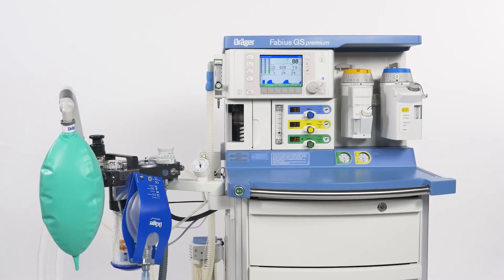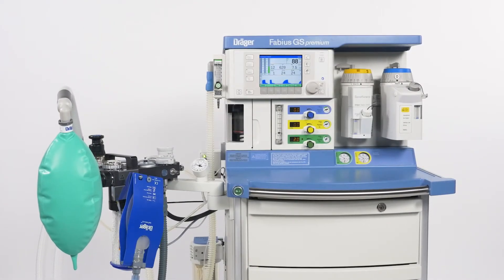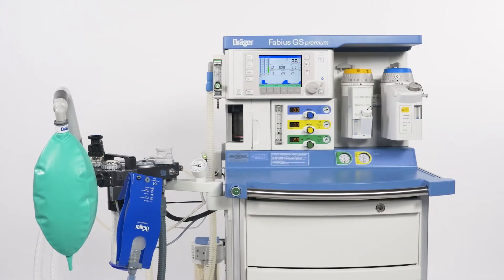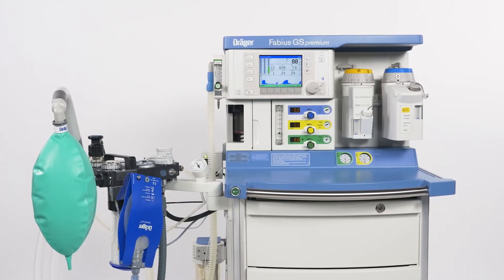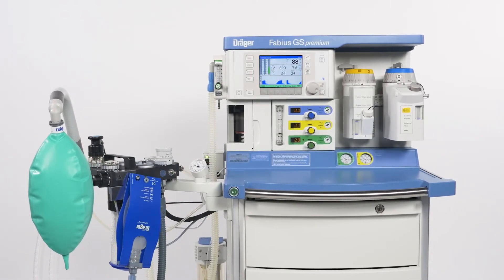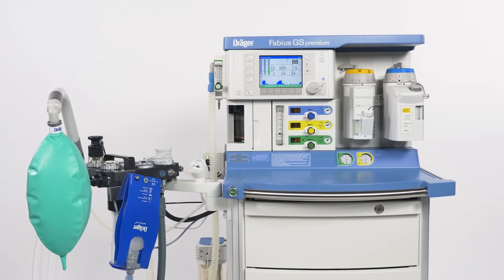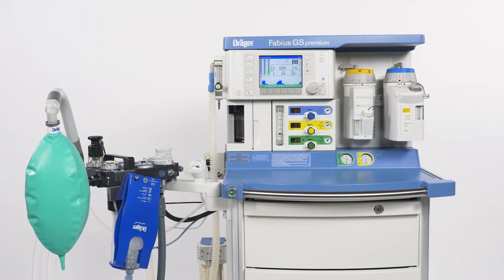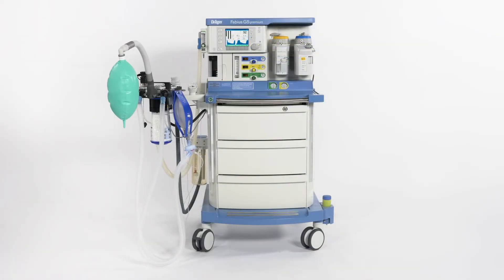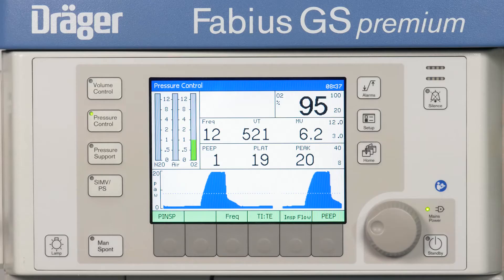Welcome to this video about the Draeger Fabius GS Premium Anesthesia Machine. We will give you a short overview of the key components of the Fabius GS Premium. We will start with the front side of the anesthesia machine.